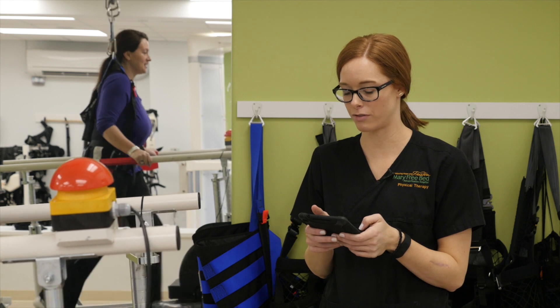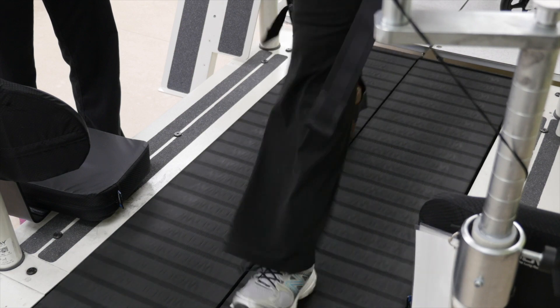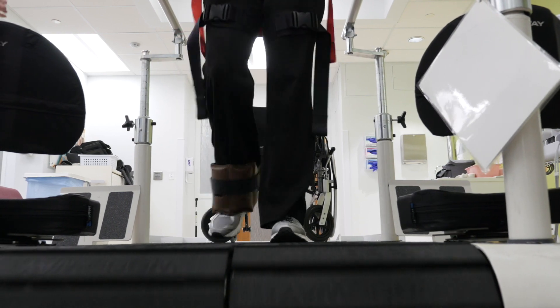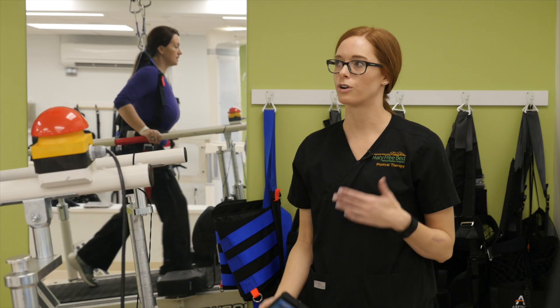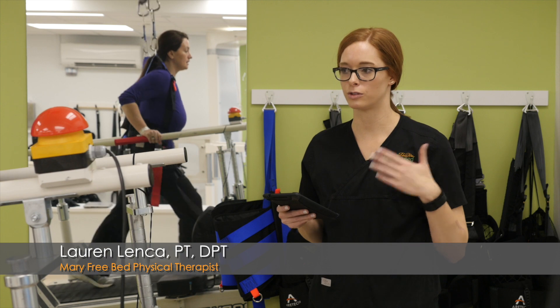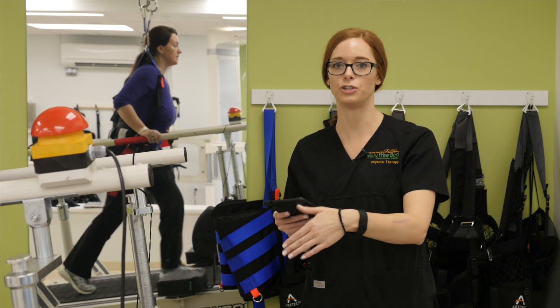I'm just going to check your heart rate — we want to be careful when we're working our patients hard, but we need them to work hard, that's part of therapy. We do monitor heart rate the entire time so we know it's safe and she's responding appropriately. Working at high intensities is what's going to make patients better, and we're seeing that balance activities and transfers are getting better as we do these things too.